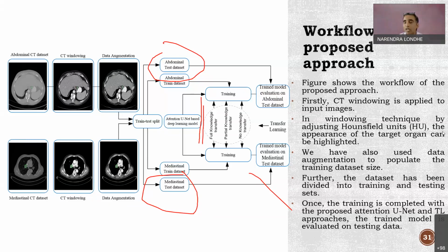The second option: if your medical expert is not available to you, you can learn 2 or 3 images on your own, and you can have your own image tracing software. Likewise, we built one image tracing software with Global Information Technologies, USA. We prepared that image tracing software and used it from there, but it is mostly for circular shapes. Where the shapes are not circular, it is better to get it from the radiologist.